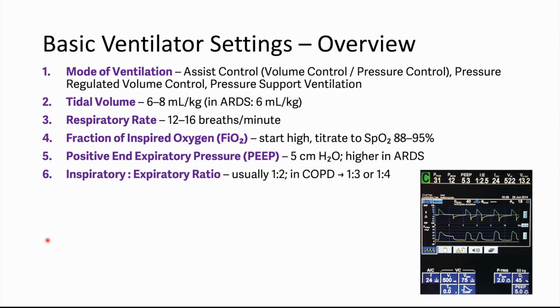So the tidal volume varies depending on compliance, which reduces the risk of barotrauma but can lead to inconsistent volumes. So two things: in assist control volume control, you set the tidal volume; in assist control pressure control, you set the inspiratory pressure.